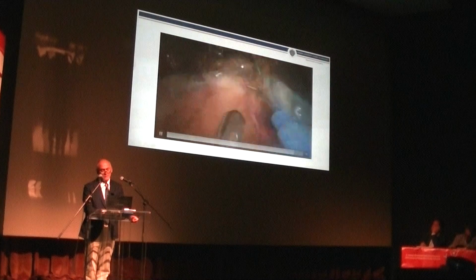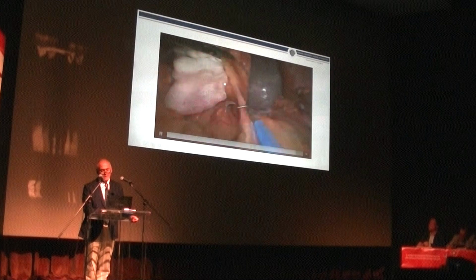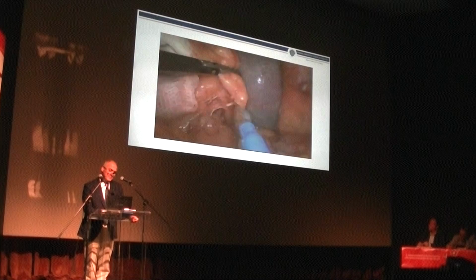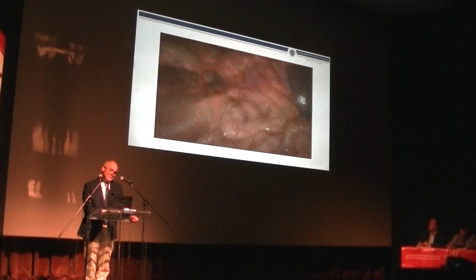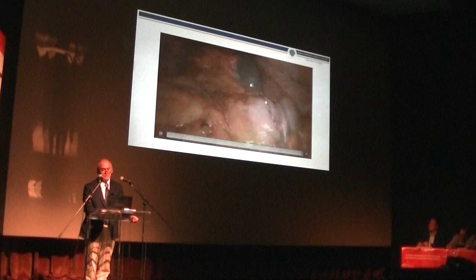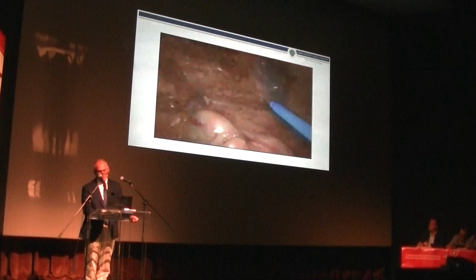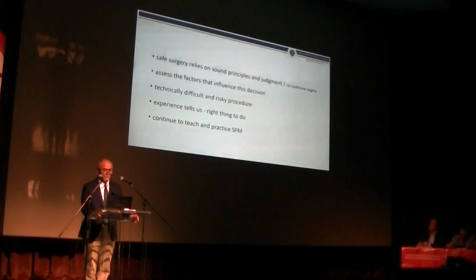And then you see the gauze that you put from below, and it allows us not to damage the pancreas. And this is the pancreas, and this is the stomach, and then this is the full lengthening of the splenic flexure to use for a very low coloanal or hand-sewn coloanal anastomosis.